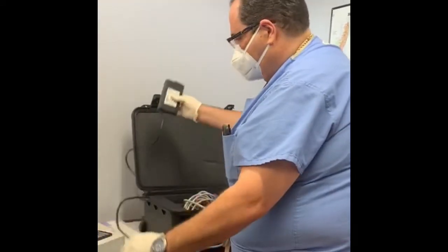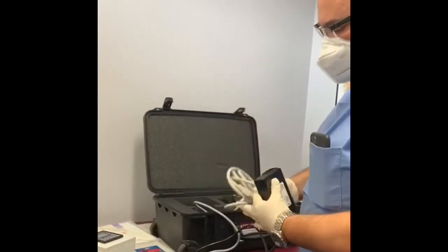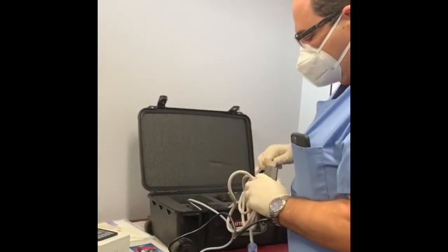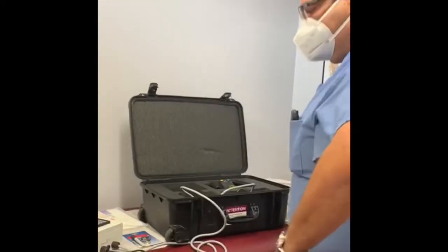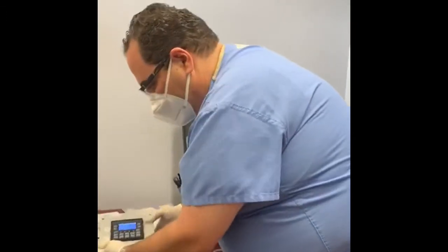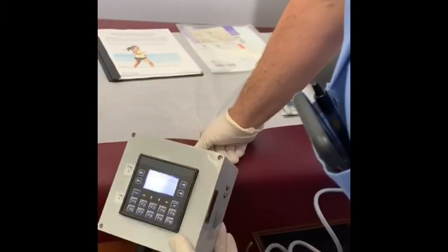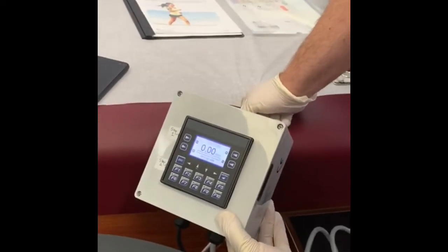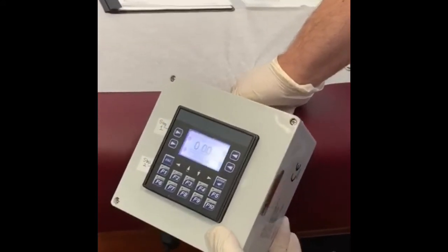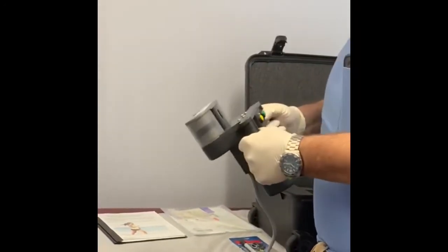The unit itself doesn't have an on/off switch, so this is the control. It has a power source and this cable connects to it, then connects to the wall. Once you plug it in, it's going to turn on and go through a self-test, and then it'll go to the home screen.